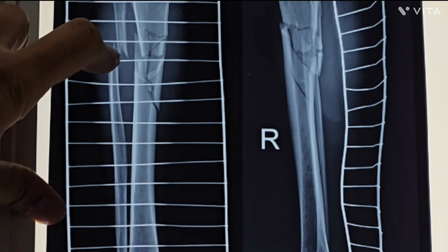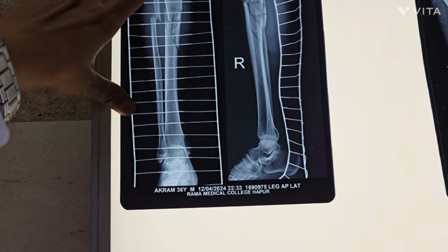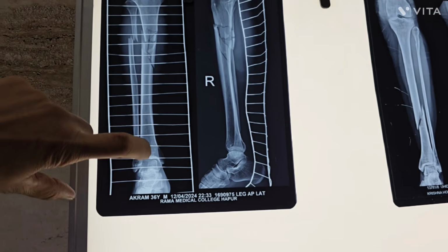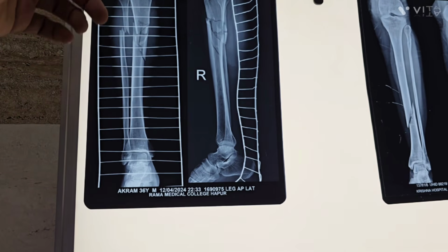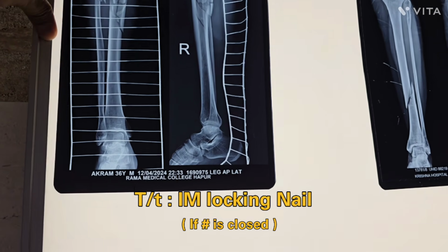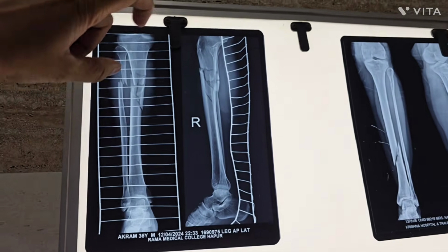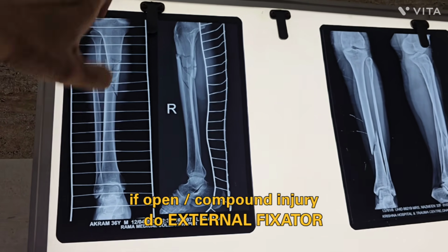So how are you going to treat this patient? Firstly, the patient comes to us in the emergency department. You can apply the Kramer wire or slab and send the patient for the X-ray, and after the X-ray you can see this. Immediately you can take the patient to the OT and apply intramedullary nailing, or if there is an open wound or compound injury, you can apply the fixator as well.